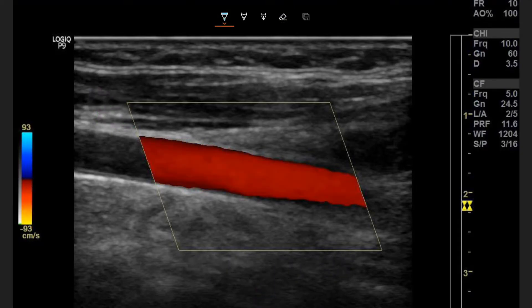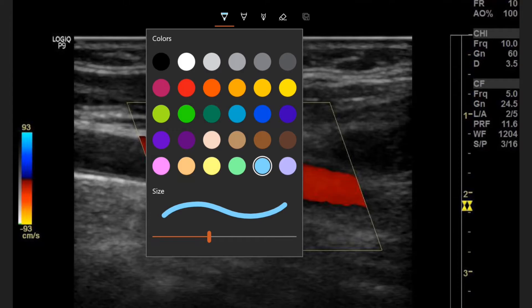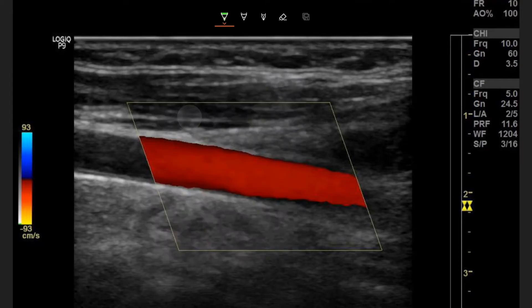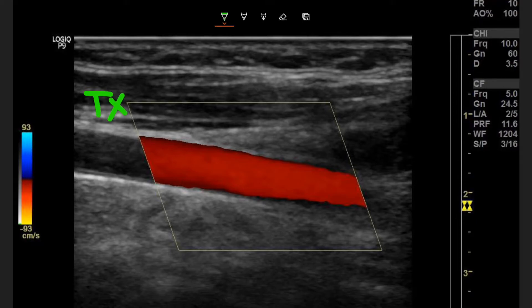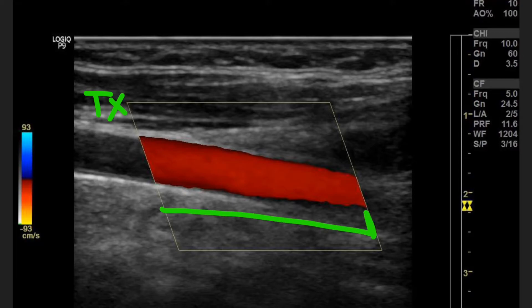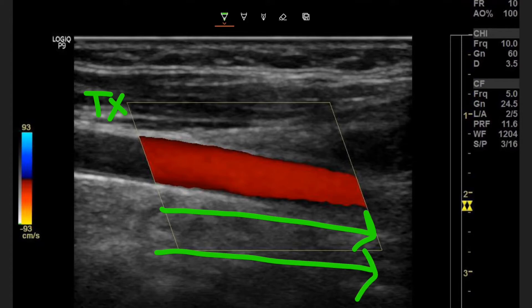Now our color map is flipped. Our transducer is still steered the same way, but our color map is flipped — so blue is coming towards the transducer and red is going away from the transducer. Our transducer location is still the same because our box is steered the same way, but red is now going away from the transducer, so we're leaving the transducer. The flow in this vessel is going from left to right.